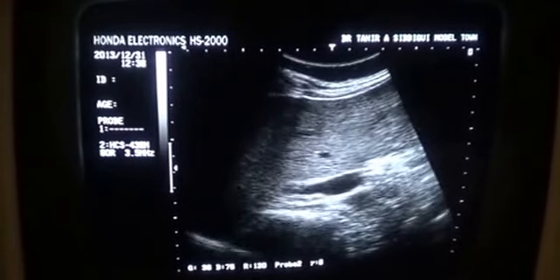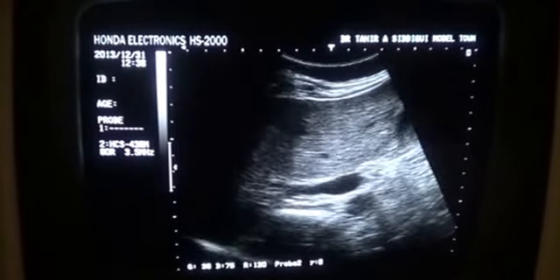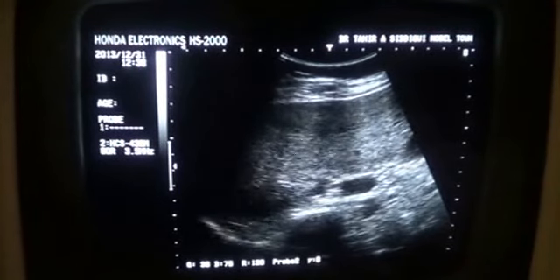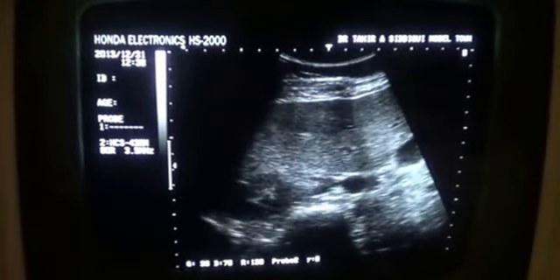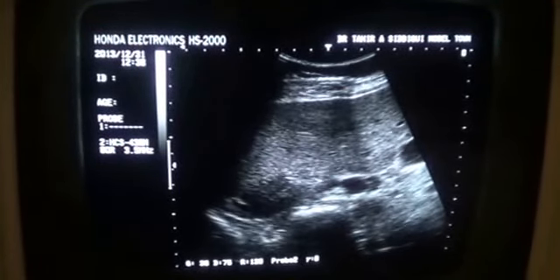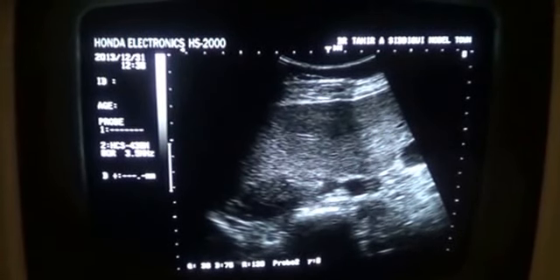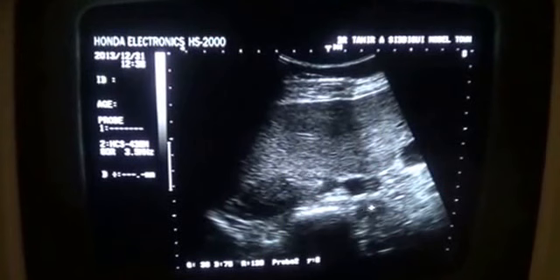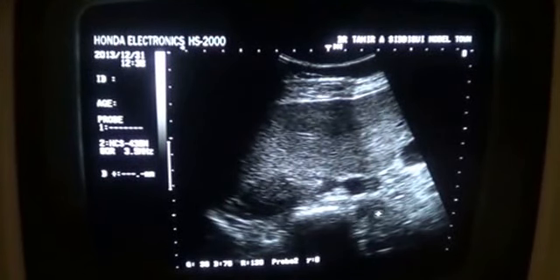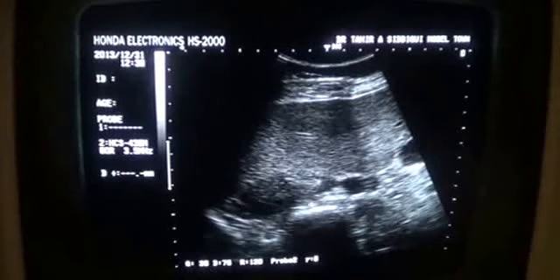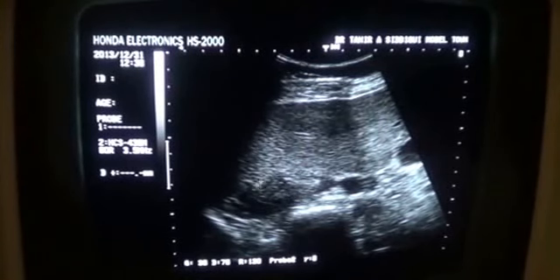Now I'm going to give the probe a sweep to see if it enters the hilum of the right kidney. Here you can see the same structure that was being seen as a tiny cystic area — this is the IVC, this is the inferior vena cava, and this is the right renal artery. This is the hilum of the kidney — it's entering into it.